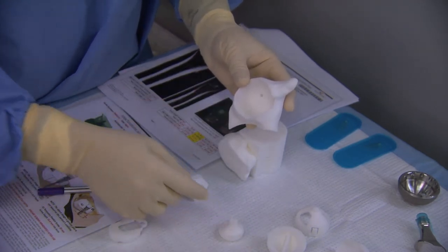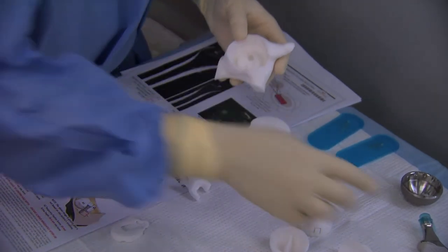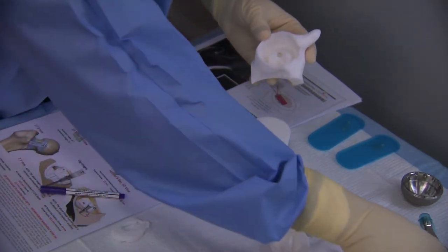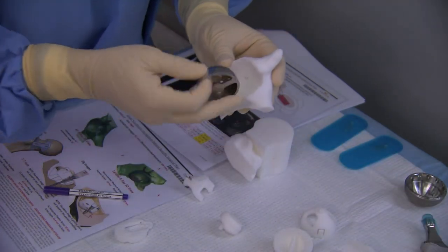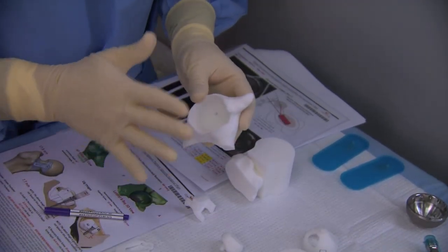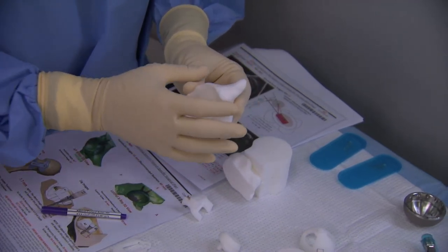Ultimately the A2 jig will be removed. The reaming happens in two stages. The first stage reamer reams the rim around the jig, and then the A2 jig is removed and the second stage reamer will ream the central bone. This actually helps keep the cup nice and centered and also controls the depth.